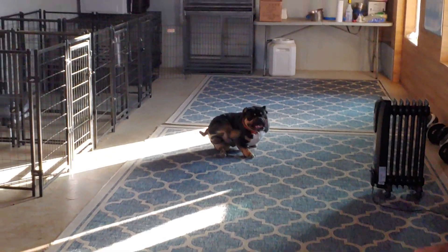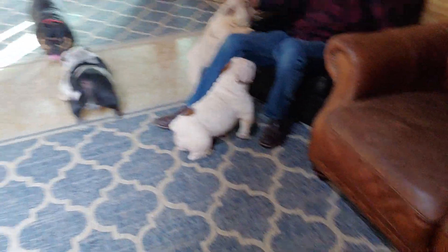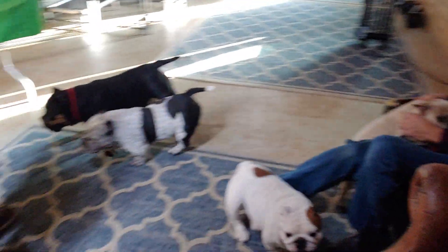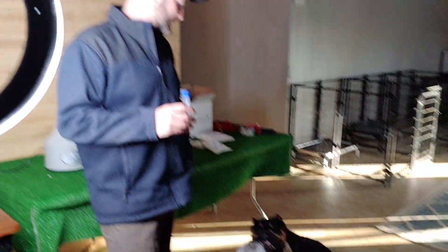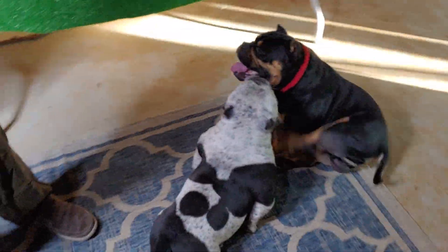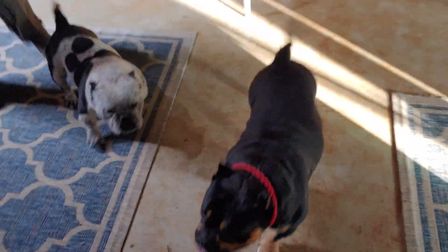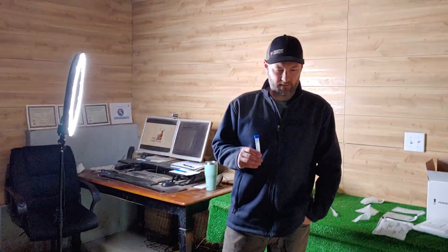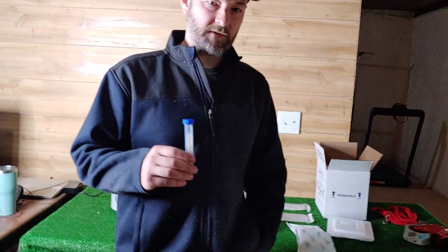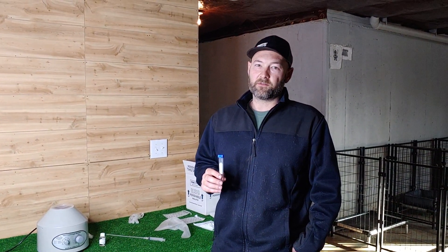I'm telling you guys, it works. Anytime you use one of our studs, you're always invited to come do two in-person breedings with me and we'll do this process together. Or we can next day ship it to you, and it really does work. We'll be shipping Champ to California next week and shipping Legend today. Even on fresh AI breedings, we spin the semen and add the extender because it will help the semen live a lot longer.